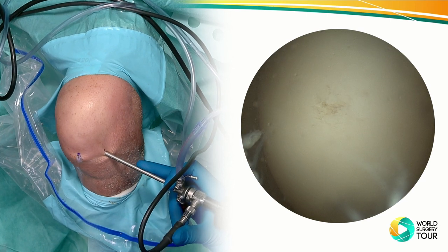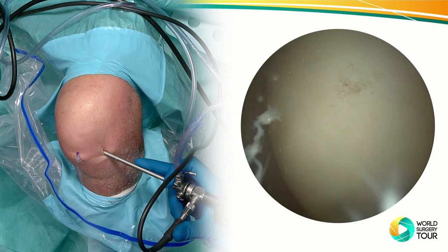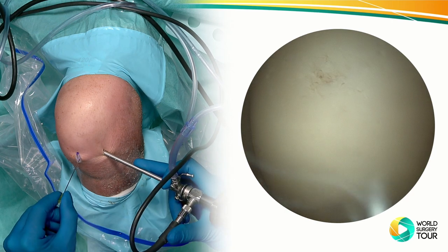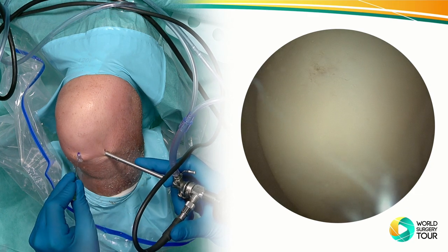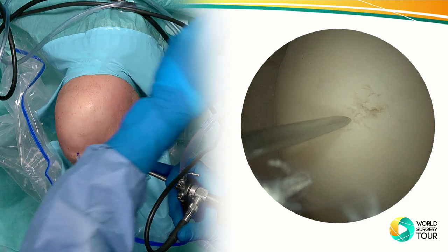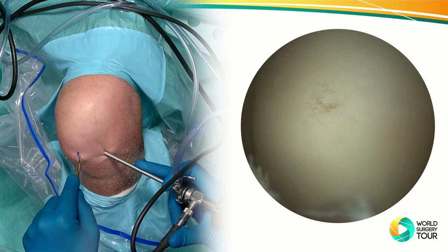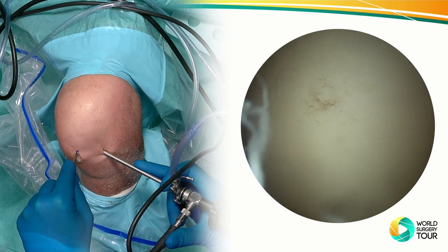First step is it's really important that you create an orthogonal access to the defect size. So ideally you take a spinal needle or any type of needle that will allow you to probe the direction. So what you want to see on the arthroscopic image that your needle will enter the joint in a way that really you hit it as orthogonal as possible. Then you take a blade and create a portal. Now again, as you saw before, this cartilage punch has a certain diameter, so you better make sure that the portal is large enough.